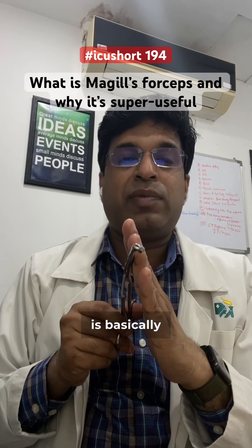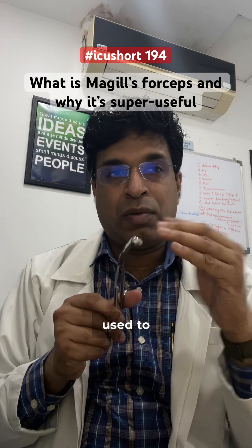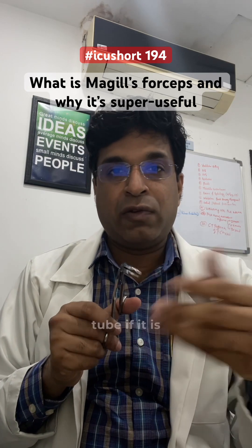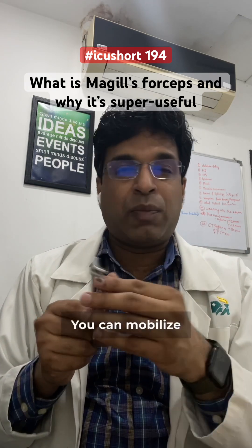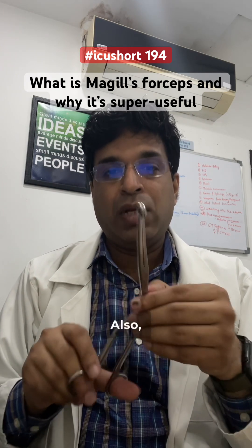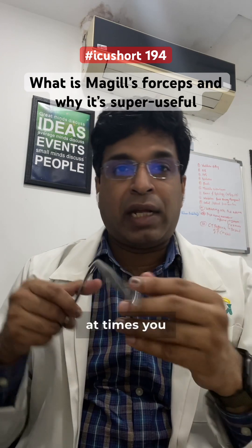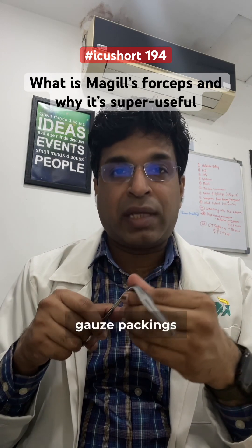This forceps is used for three to four purposes. Most commonly it is used to put the nasogastric tube if it is not going easily, to mobilize the endotracheal tube during intubation, to remove a foreign body in the oropharynx, or to place gauze packings in the mouth.